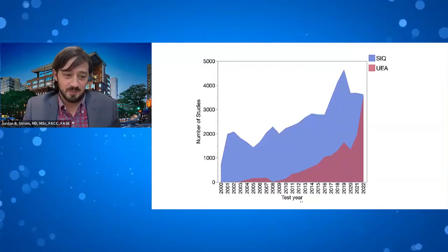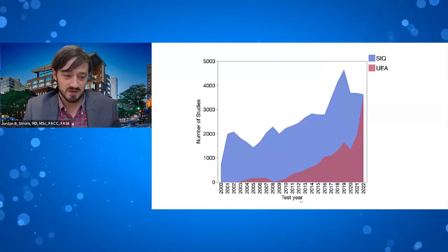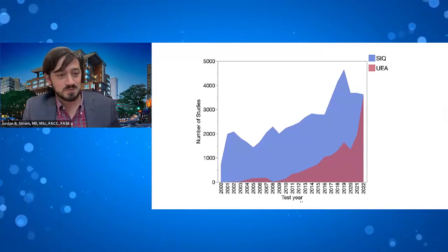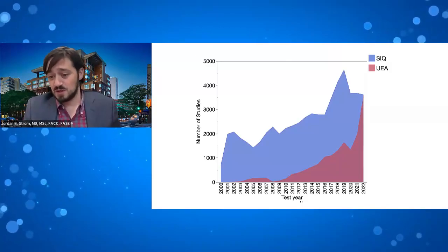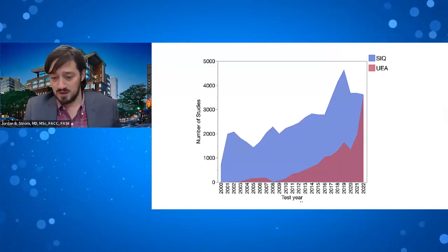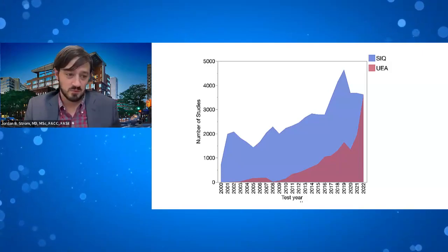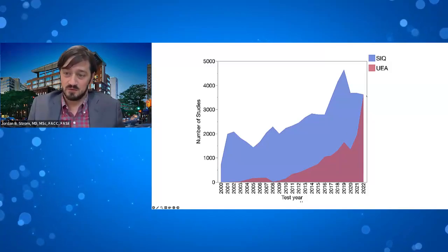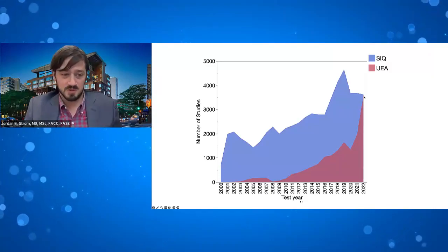Steve Feinstein, who many of you may know, has been integrally involved with the ICUS. He looked at the slide and told me, Jordy, you really should be updating this, because we did do a big push after this study was released to change policy and practice within Beth Israel. And this is something that Jessica will speak to as well. But now you can see that the rate of contrast use has really caught up with that of suboptimal image quality.